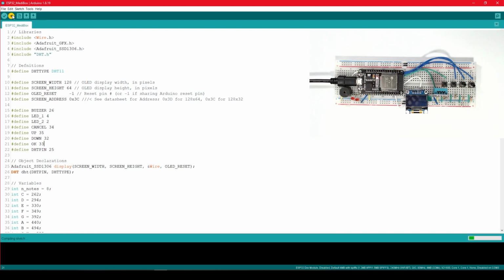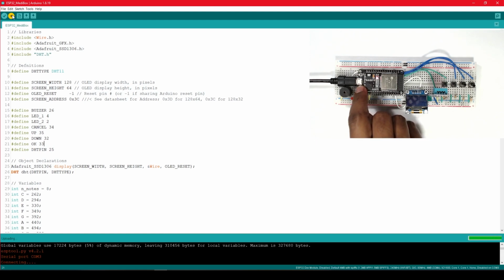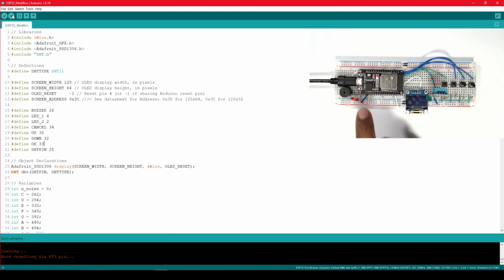After it has successfully compiled, I will now upload my code into the ESP32 on the breadboard. Remember that you have to press the boot push button on the ESP32 while the code is uploading. After the code has successfully uploaded, I have to press the reset button on the ESP32 to boot the ESP32 to execute the program from the beginning.